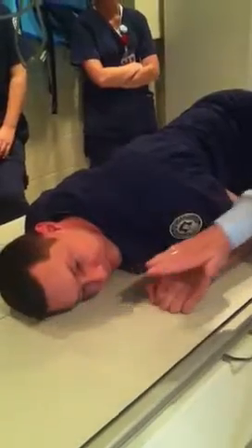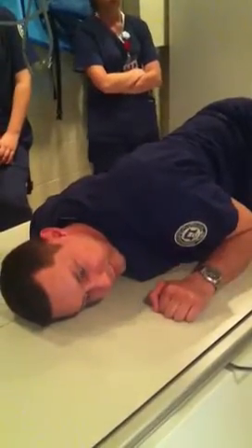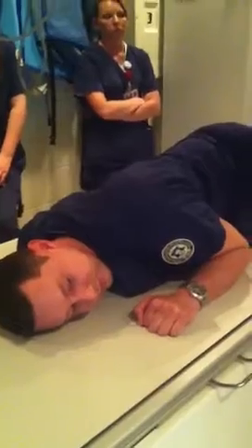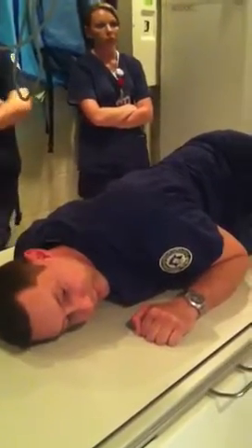Now, lay the patient's head down, and those things that we needed to talk about, right? Mid-sagittal plane. Is it parallel to the image receptor? And if I look at this, I can see that he's got a downhill slope. His head is going downhill. So this is a bad thing. It's got to be square.